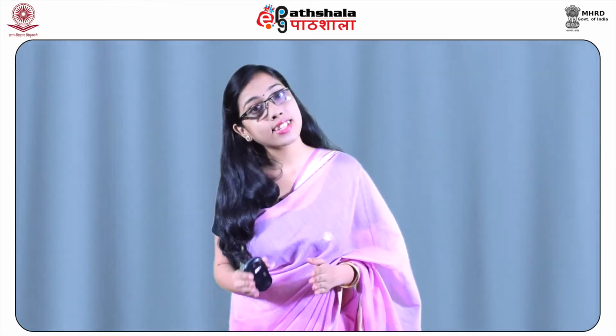However, the toxicologist will often be challenged with compounds for which no suitable extraction procedure is available, necessitating the development of a new procedure based on available data of the target compound. In the worst circumstance, neither the physicochemical properties of the target compounds nor the composition of the specimen is known, because of the large number of toxicologically relevant compounds and the different questions that need to be answered in the various fields of analytical toxicology. A universal standard extraction procedure does not exist.